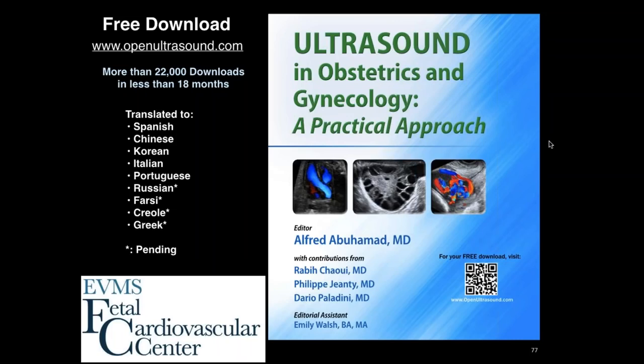How do we differentiate CAT from pulmonary atresia with VSD? So in CAT, there are some things that are required for CAT diagnosis. You know, in CAT, there's a central vessel that comes from the heart. Many times there is valve dysplasia there, so you see some regurgitation from the jet. There are many leaflets, many times 4, 5, or 6 leaflets there.